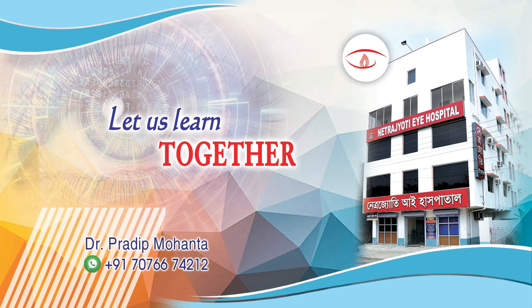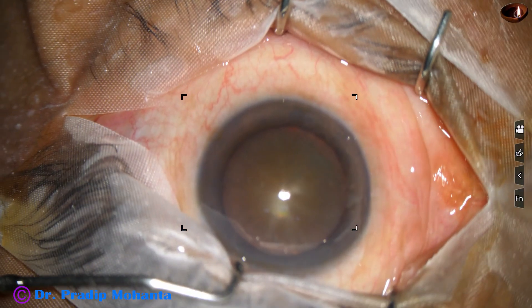Friends, welcome to my workplace at Ranaghat, West Bengal, India. Let us observe this surgery.